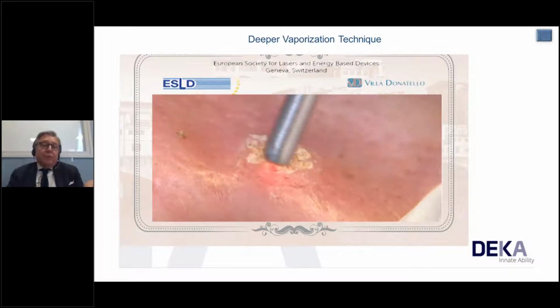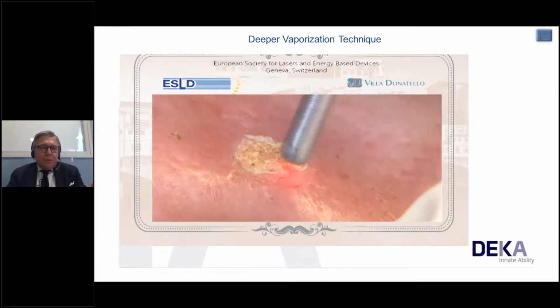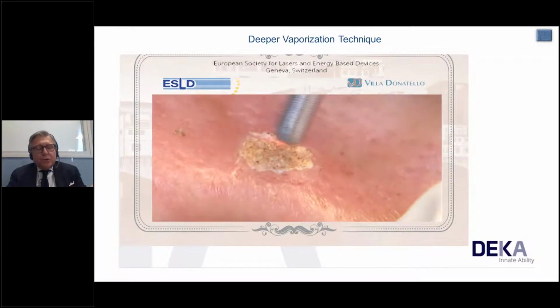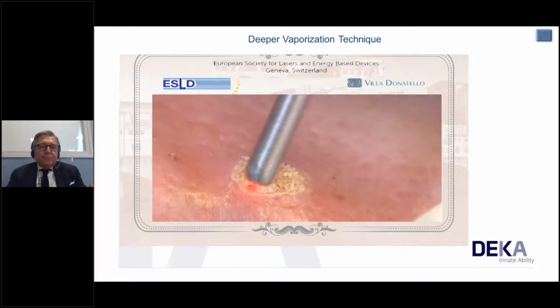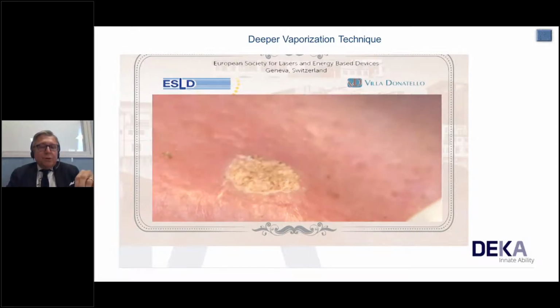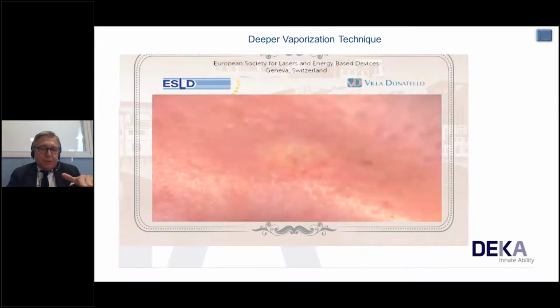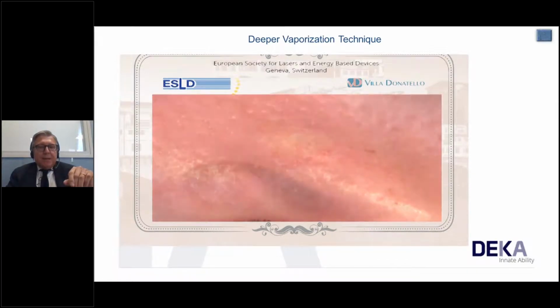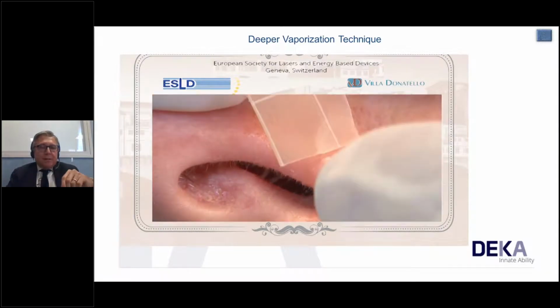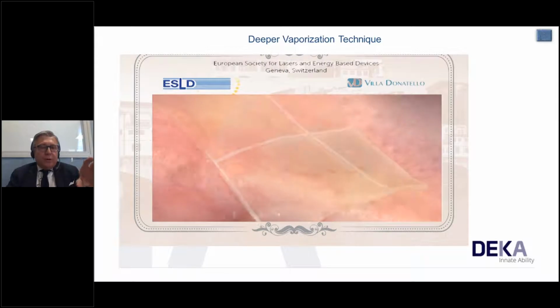It's very important even to understand the end point. It is one of the most important problems, when to stop our procedure. And if you note in the lateral view, side view, you can see a very modest depression of the skin that you can see here. We have to get this result, this endpoint. We sometimes cover with a sort of hydrocolloid dressing.